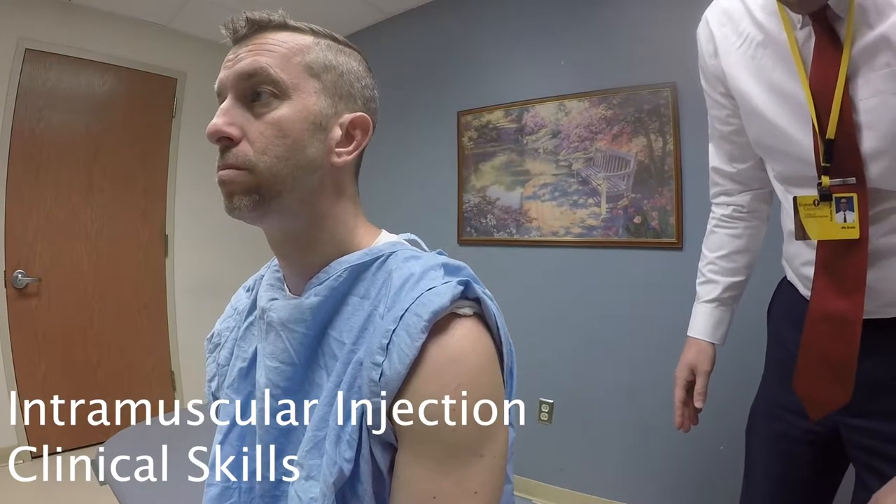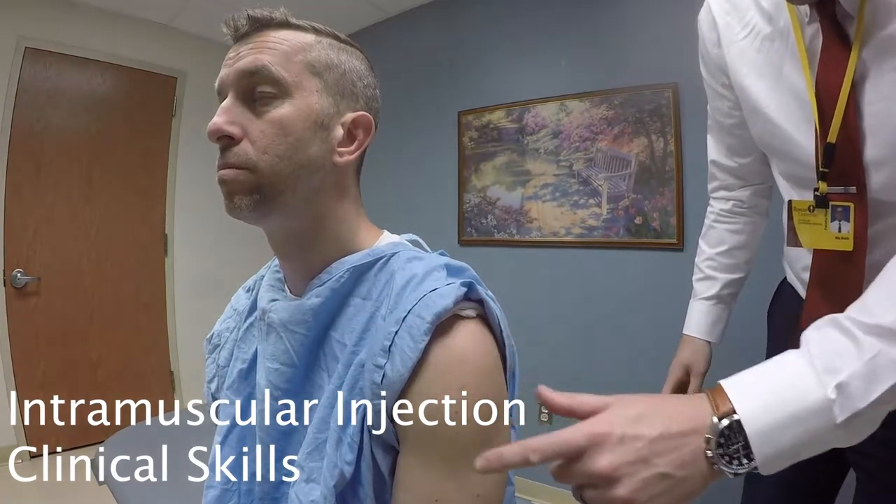Identify the site for injection. If performing an intramuscular injection, we're going to be using the deltoid.